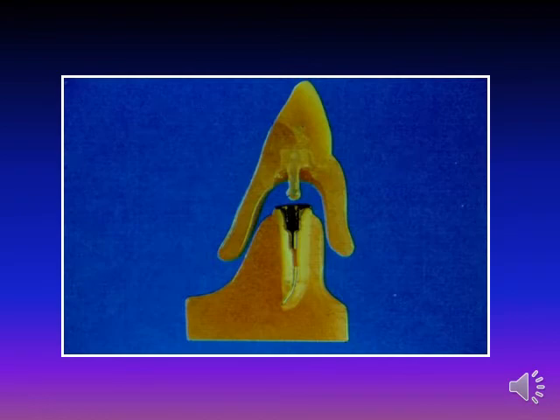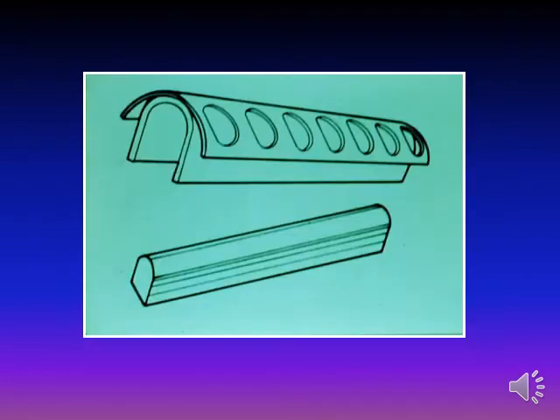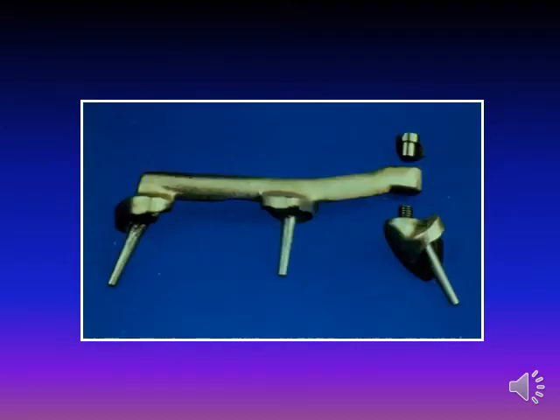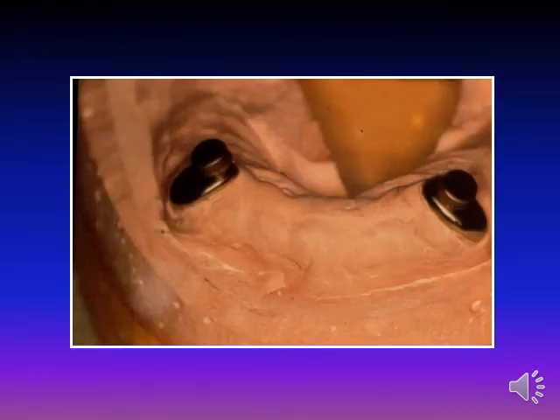This is a stud attachment, a bar with stud attachment, a bar with Schubiger attachment, which is used with non-parallel abutments, like this. This is magnet attachment.